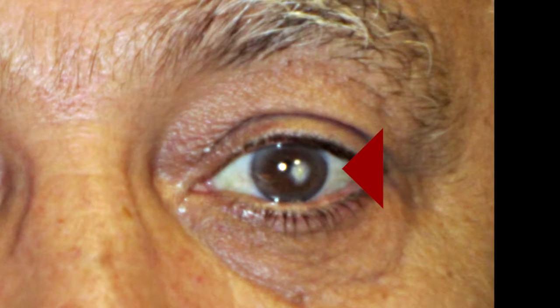Therapeutic options were discussed, and the patient was informed that the best course of action would initially involve the removal of the cataract only. After a thorough explanation of the potential need of a corneal transplantation, he was reluctant to have any surgery on this eye, since he had the cosmetic blemish for his whole life. A year and a half later, he returned to the office, asking to have only the cataract removed.